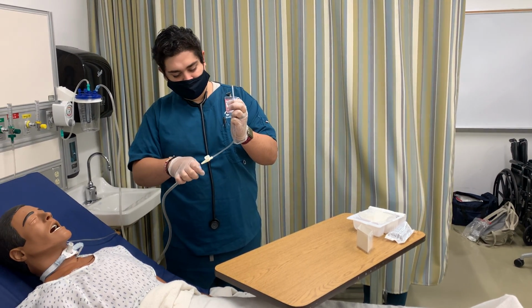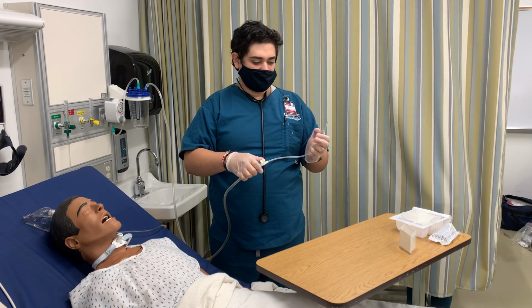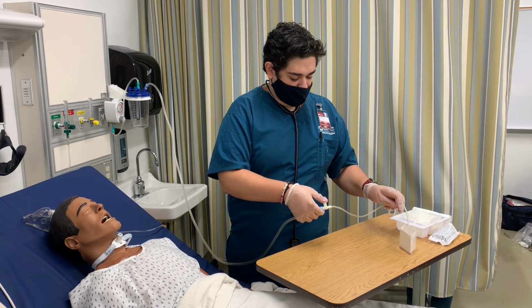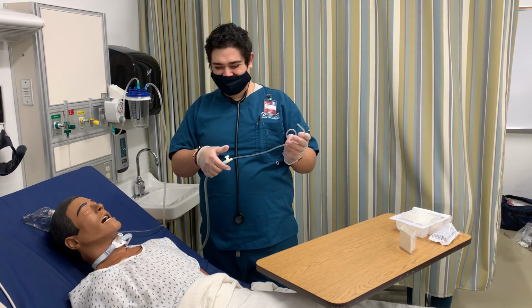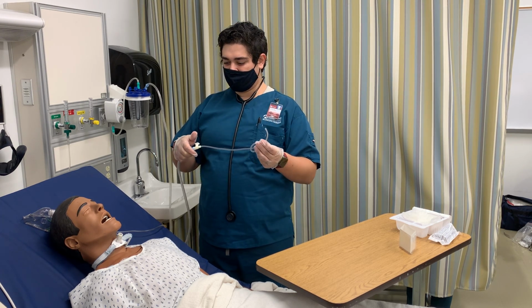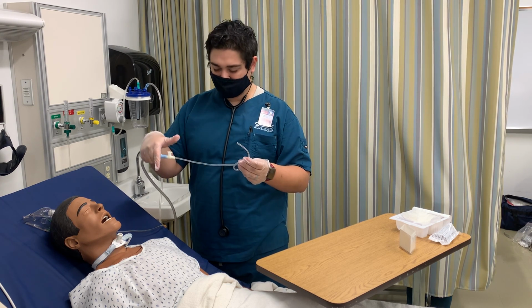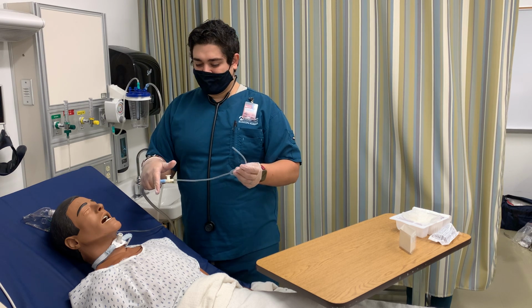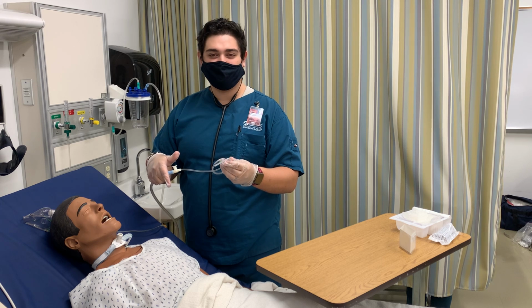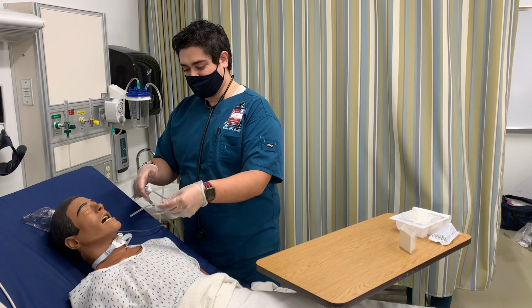I just moved this out. Are you ready? Okay. I will be testing my suction here and my saline boat. So my suction is working now. Now I will be putting it into his inner cannula, stopping if I feel any resistance, but I will be going no more than 6 to 8 inches. With the markings here, that's 15, 20 centimeters here.